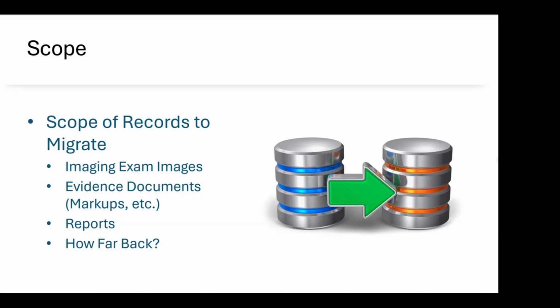So this is an issue where you have a PACS that has 25 years of images and reports, and an EMR that when it went live, they only imported 7 years worth of reports, and it's now 3 years later. So they have 10 years. So if you're going to decommission that PACS, in some cases, it's the only system that still has those reports. So you have to decide, are we going to do a report extraction from the legacy PACS system and into the new system?